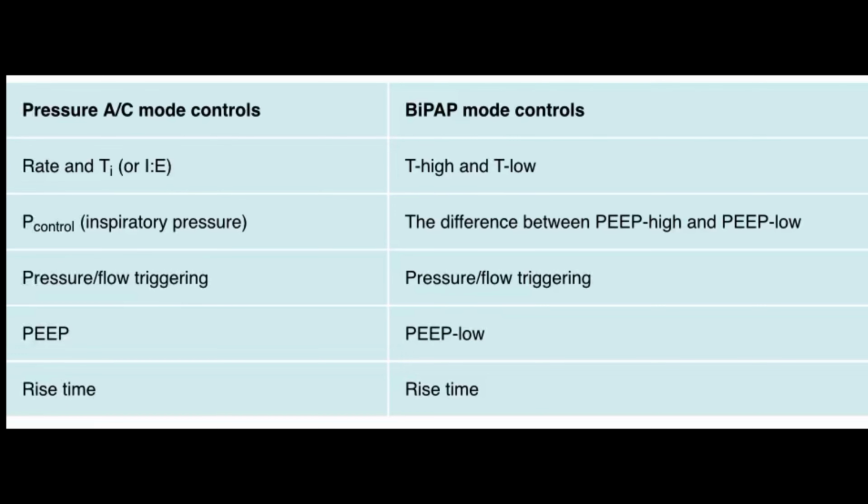Some intensive care unit ventilators let you add extra pressure support to spontaneous breaths. But operators need to be careful because pressure support is specified differently in different ventilators. Make sure that you clearly understand how the ventilators in your unit work or define pressure support before applying it.